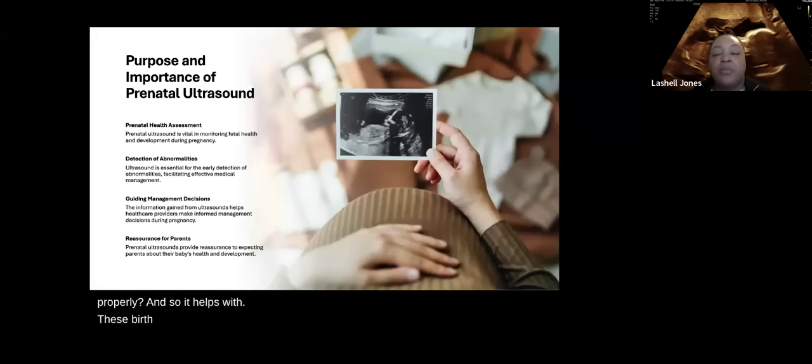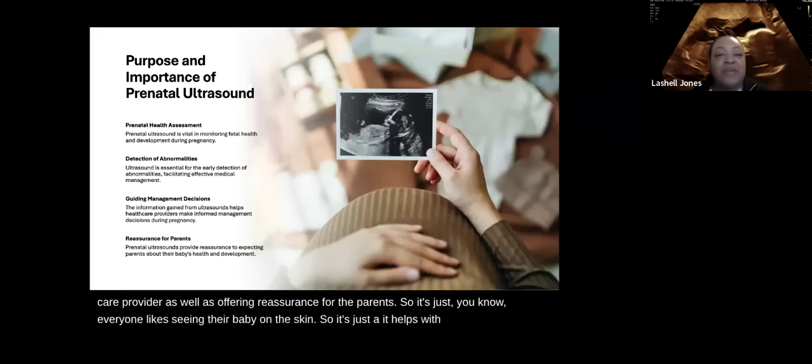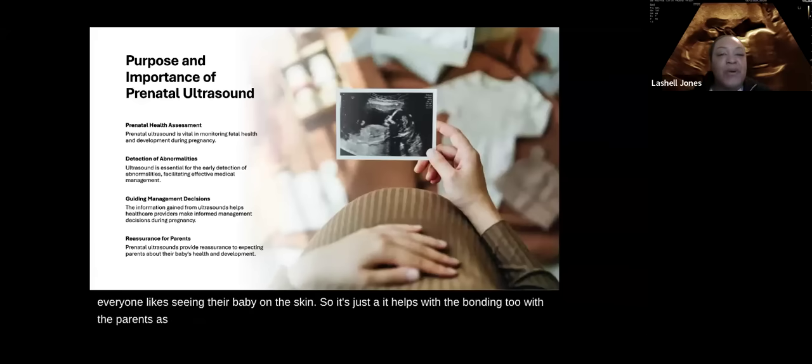And from there, it helps guide management decisions for the healthcare provider, as well as offering reassurance for the parents. Everyone likes seeing their baby on the scan, so it helps with the bonding with the parents as well. So that's the purpose and the importance of prenatal ultrasound.